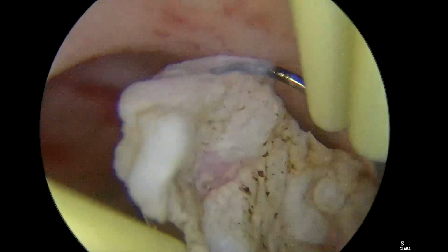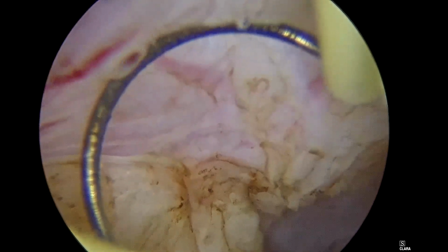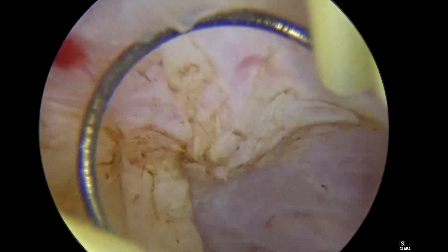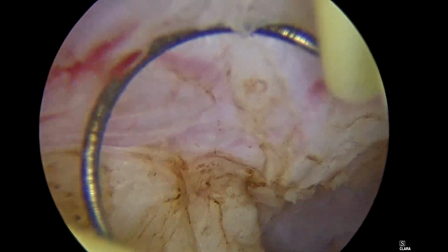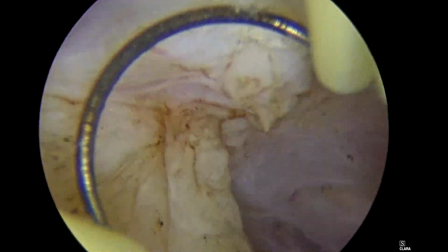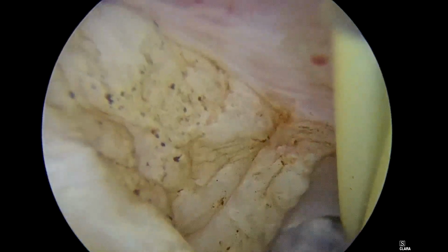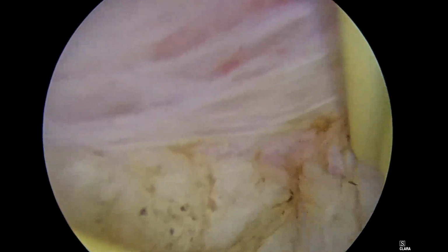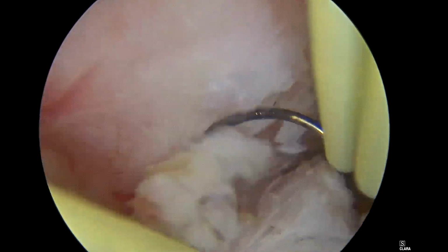That's why I could have this bleed. You still have some open vessels. You can see the mouth of the bleeder. Don't panic. Come close, touch, and then push the coag pedal to secure this blood vessel. And keep on resecting.